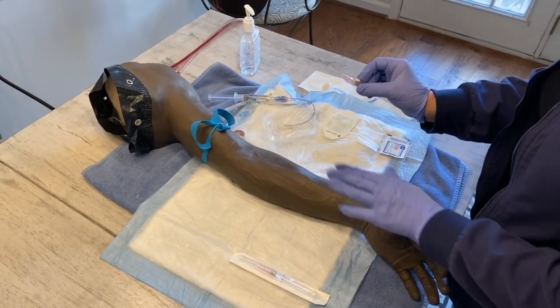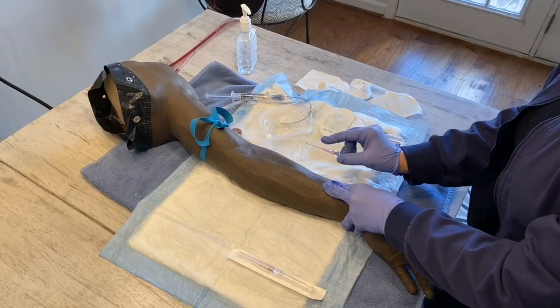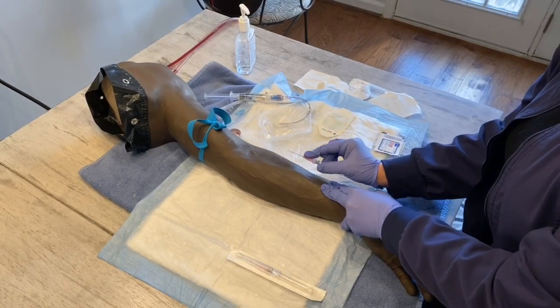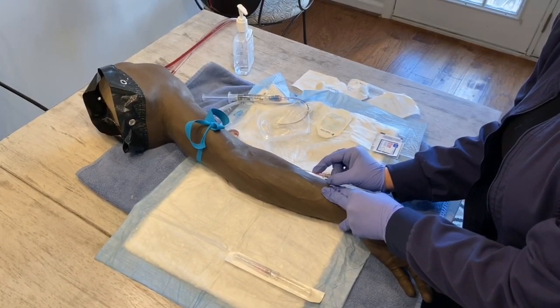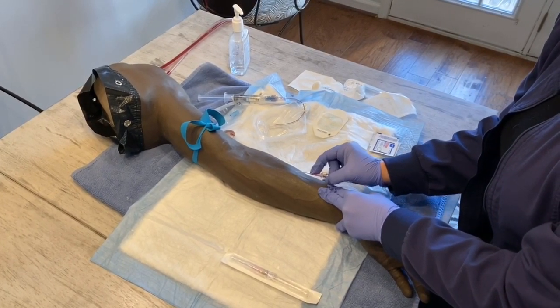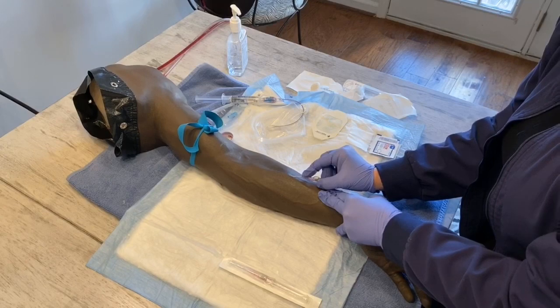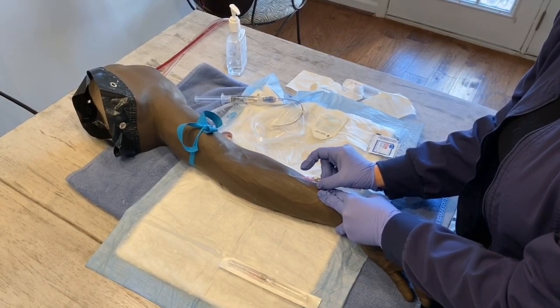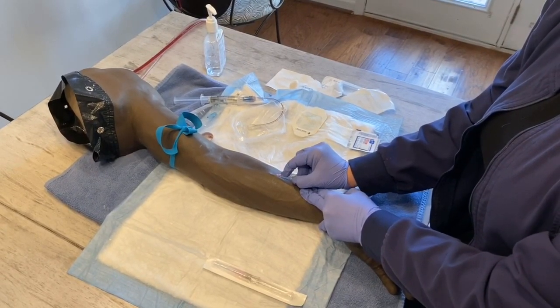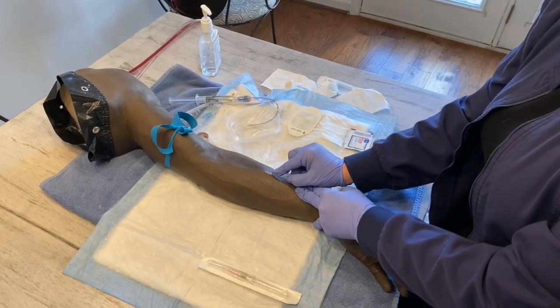I want to go ahead and take my non-dominant hand and hold below to stabilize the skin in the vein, so while I insert, I have a more stable environment. You always want to stick bevel up. I'm going to go ahead and take my hand down. And I like to put my hand against the patient because that will help me stabilize as I stick. As I go in bevel up at a 30-degree angle, I stick the vein. And as soon as I can see a flash of blood, I'm going to go ahead and slowly insert the catheter into the vein with my finger against the stylet till the skin meets the hub.